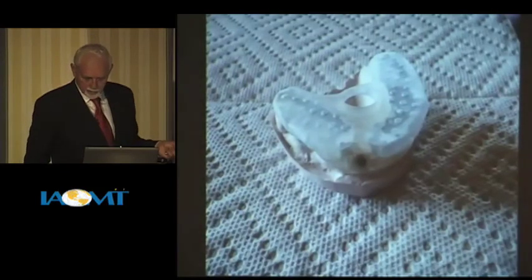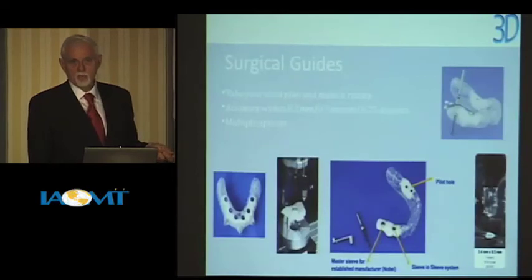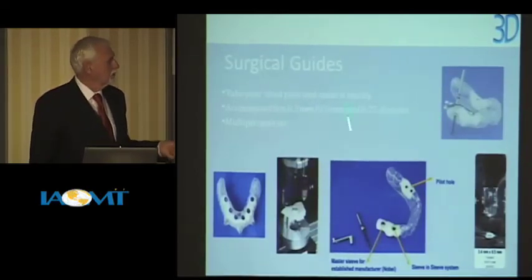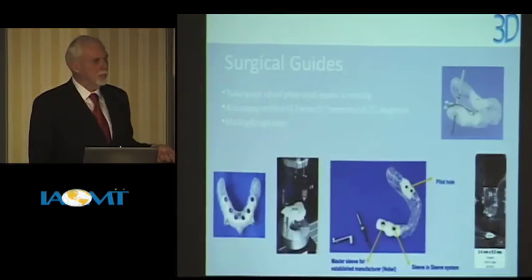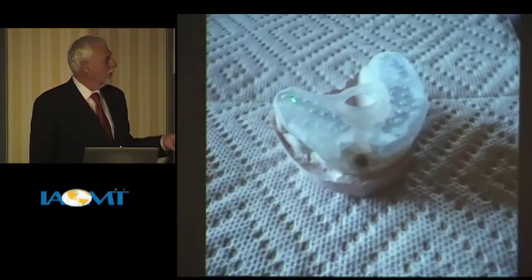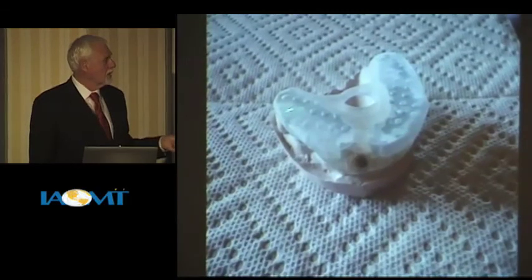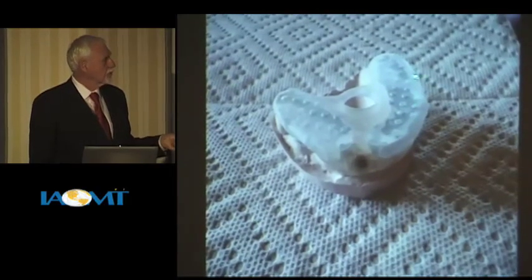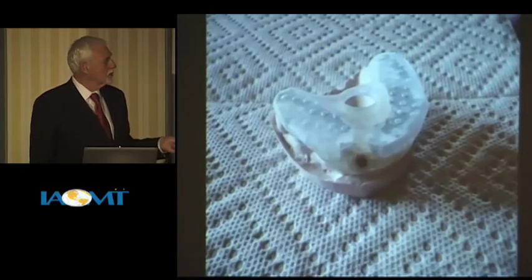We can talk, but that's not what this is about. This is a little bit of, you can make the surgical stents. First couple times we ordered those from Germany, it was ugly. A lot of those things you think it's going to be simple, and there was something we were missing, but one of the things we figured out is you can do just a bite registration inside. You get this guide that comes from Sirona, and then you have to attach that to the teeth, and then you put that in and take a CAT scan, so that then you can measure things.